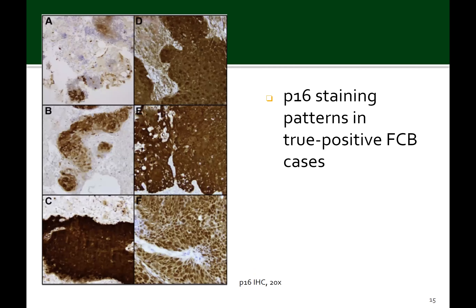Now looking at the formalin-fixed cell blocks: 15 of the 22 were P16 positive and confirmed on surgical material. They showed 10 to 100% nuclear staining and 30 to 100% cytoplasmic staining, as seen in panels A and C. All staining was moderate to strong in intensity. Panels D, E, and F are the histology-confirmed staining for the cases shown directly to the left.